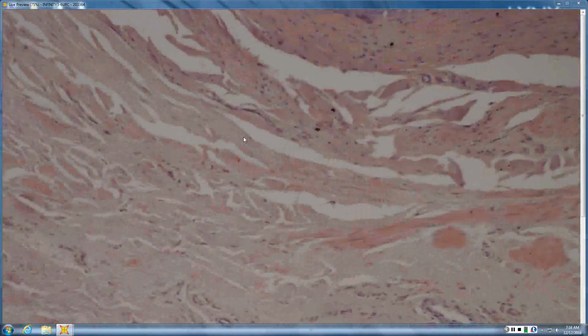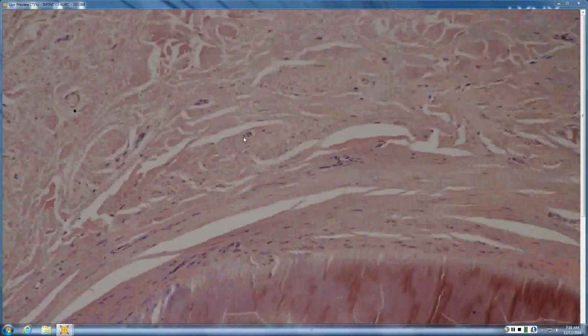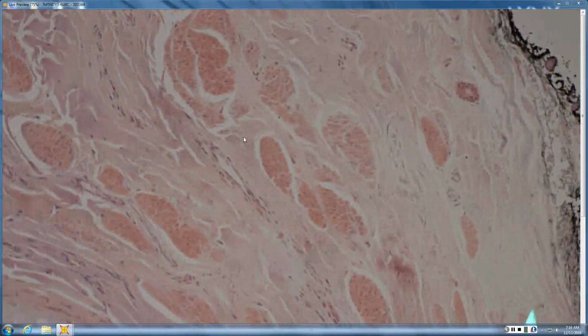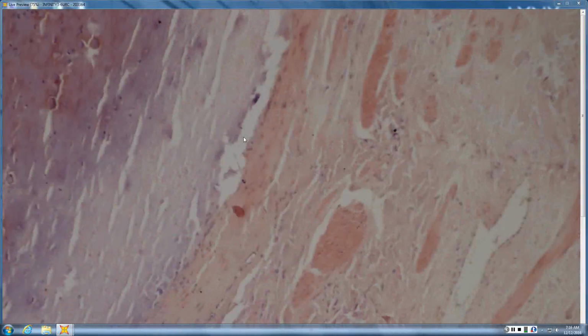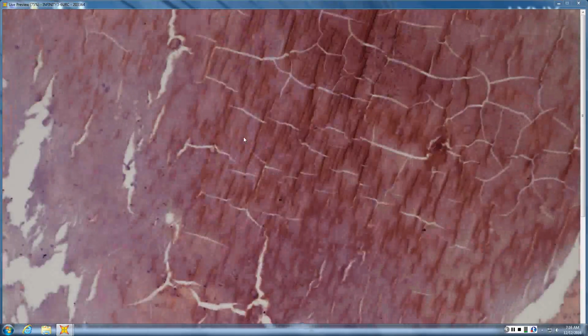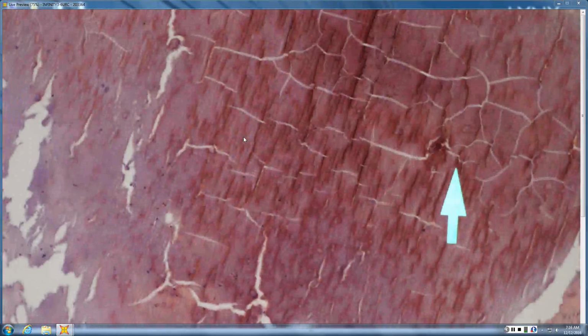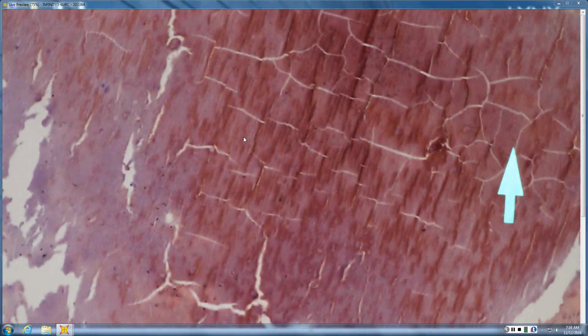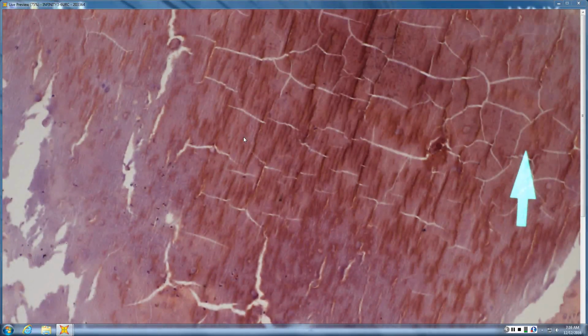Yep. So those haphazardly arranged smooth muscle bundles, right? They're not pilar erector muscles because they're not lined up appropriately. Those are all over the place and they're fine and wispy. And this is calcium. Ours is generally more purple here, like dark purple.